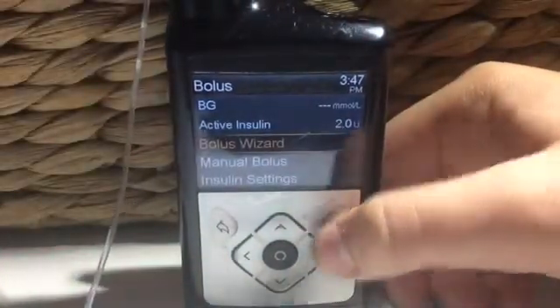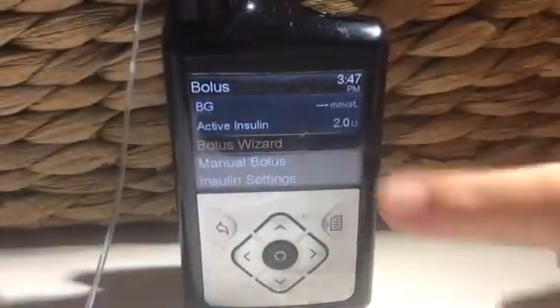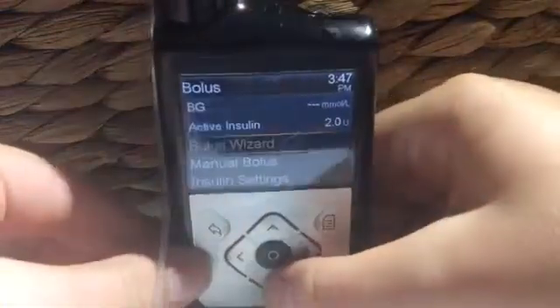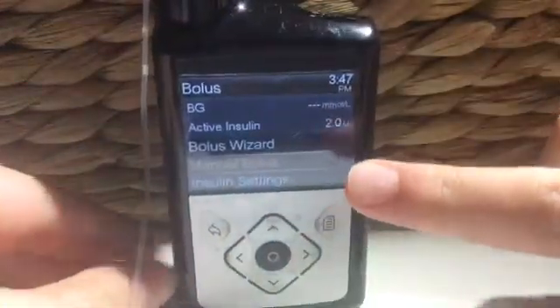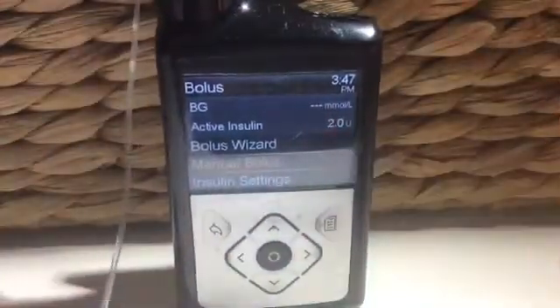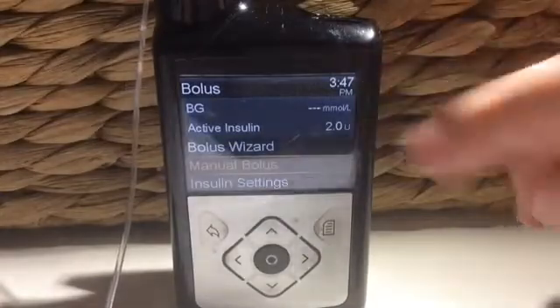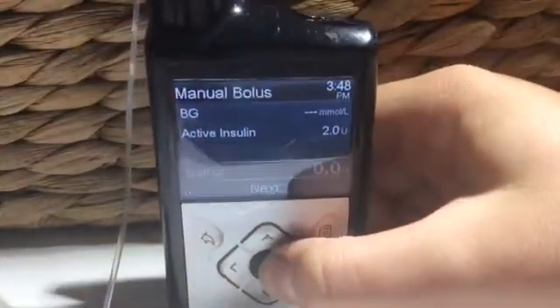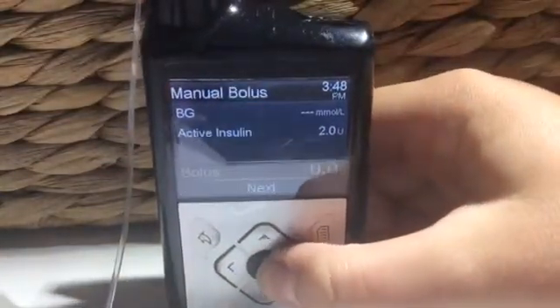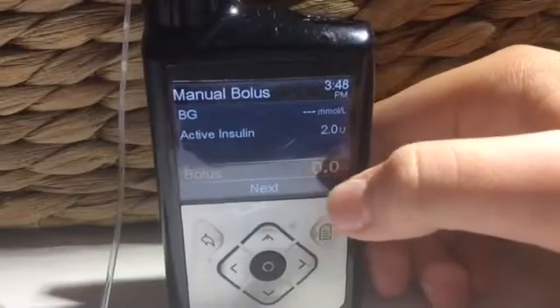The next one is called a manual bolus. This one is for insulin, so if you just want to give a certain amount of insulin — as you can see here when I click on it — you will see that you just enter the amount of units.